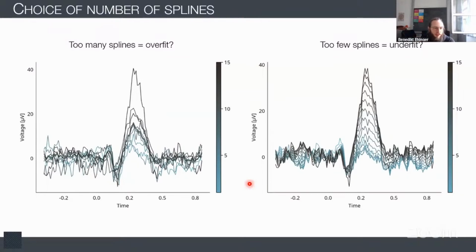Why do I then recommend using something like 5 splines? Because I think most of the relationships we have, you wouldn't expect to be really crazy, or maybe you should, but we are coming from a world where we're not even fitting linear models, so linear relationships. So maybe we can slowly open up to more complex models.